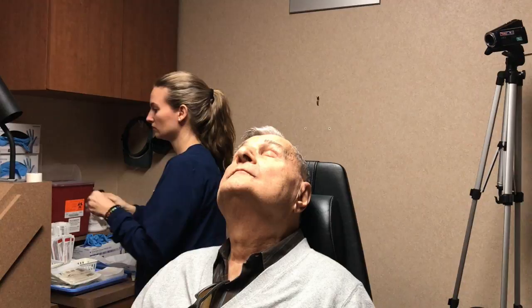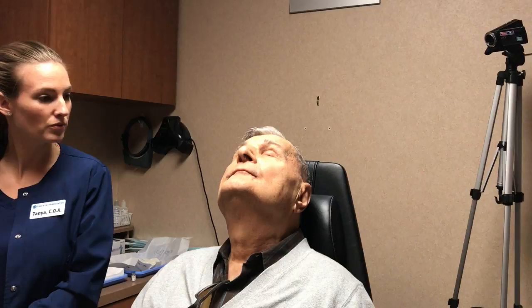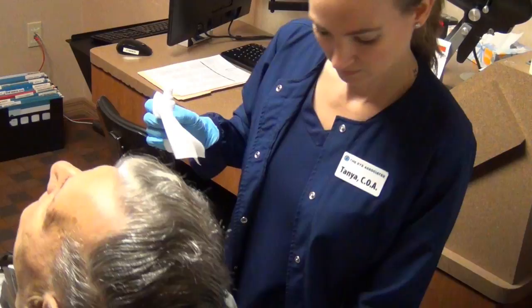Good, gently close. I'm going to get my gloves on and I'm going to go grab Dr. Malley — we'll be in in just a moment and we'll talk you through the whole procedure. So we're going to do the right eye, correct, Robert? Right eye. All right, here we go, my friend — piece of cake.